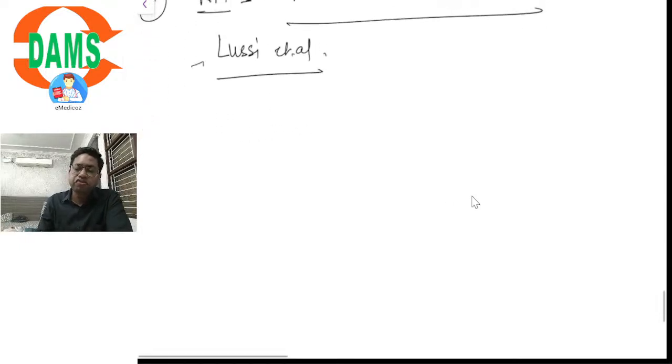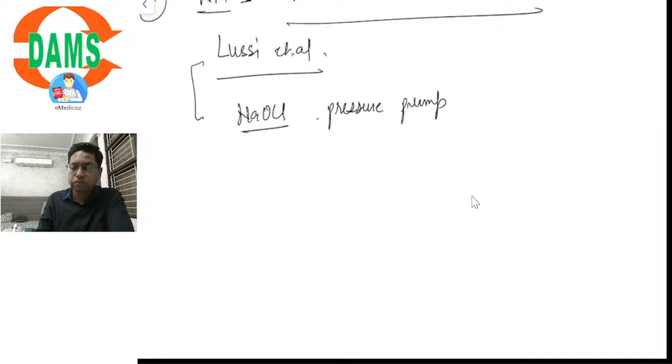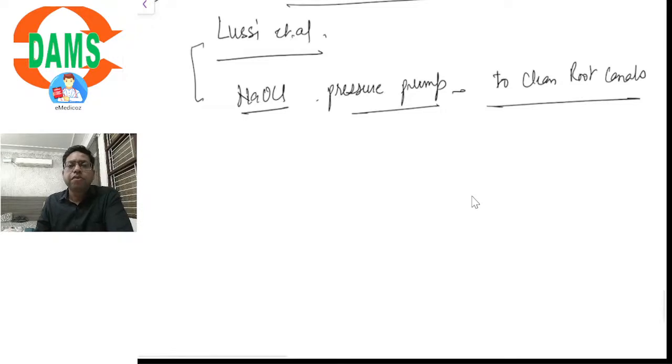What did she use? She used a sodium hypochlorite pressure pump to clean the root canals.